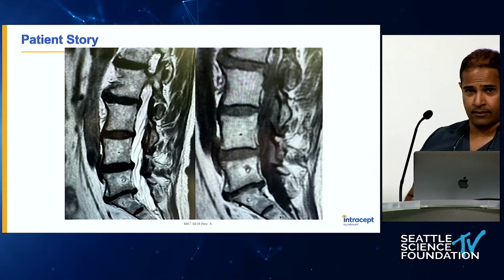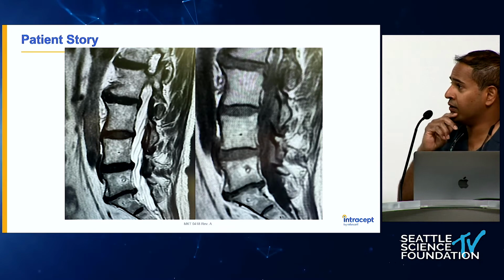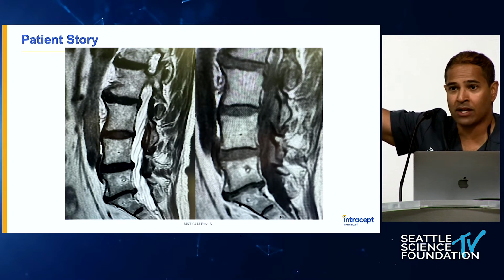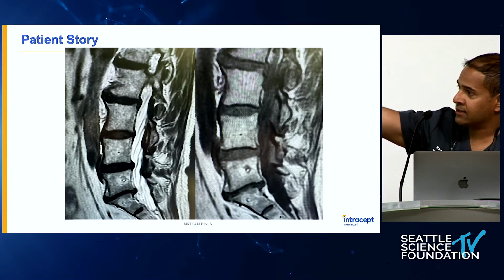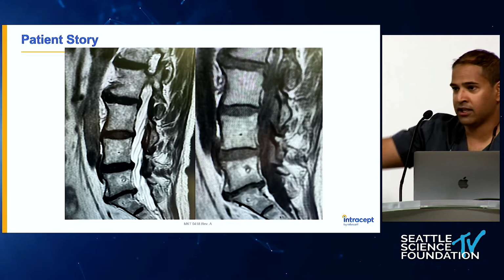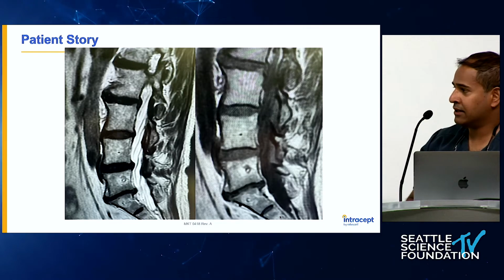So I got an MRI because I was like, what the heck? Maybe my S1 was off. I don't know. We're still figuring all this out. So this is also good for your radiologists in your community to know. What does it look like after a BVN ablation? And as you can see here, the hyperintensity of the lesion, and you can see where the BVN is. And I don't know, Doug, you tell me, you criticize me. What do you think? You can always see your work afterwards. Do you like it? Do you dislike it?